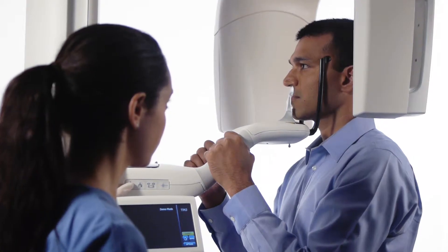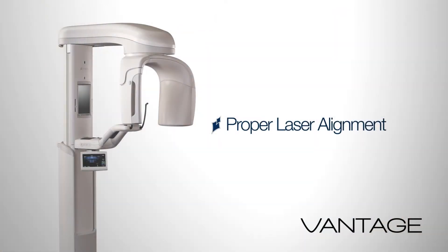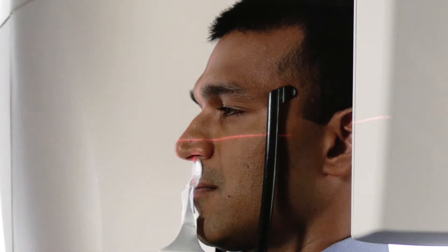Ask the patient to stand at full height and relax the shoulders. Adjust the Frankfurt plane laser to align with the base of the patient's orbit and the top of the ear canal.